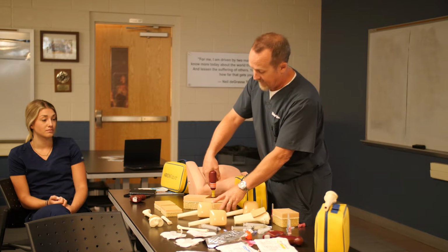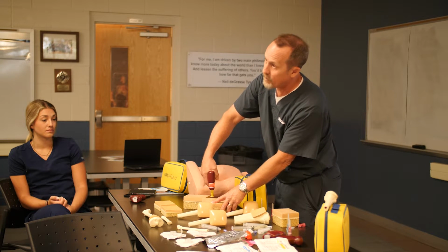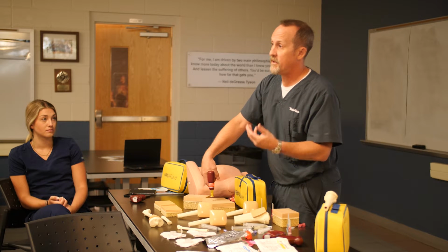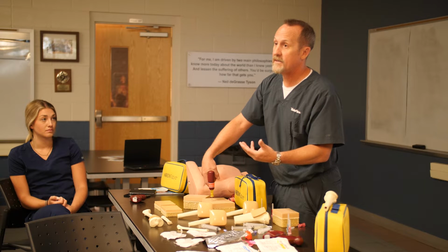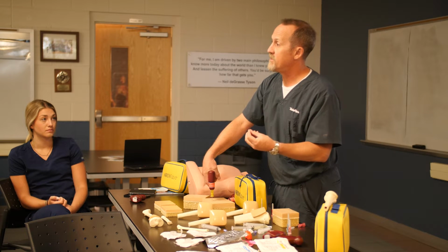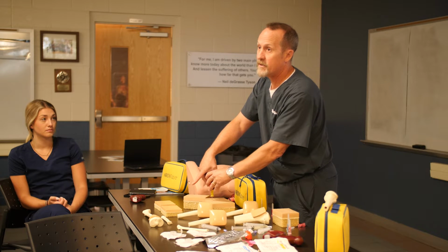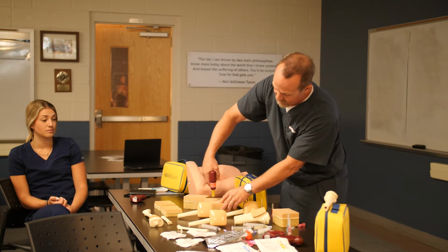So we're going to activate the driver until we feel a tactile loss of resistance. You're going to feel resistance when we're going through the cortex. The minute you feel that loss of resistance, you can let go of the trigger. We don't want to recoil or anything like that, just let go of the trigger very gently. So I'll just demonstrate here.